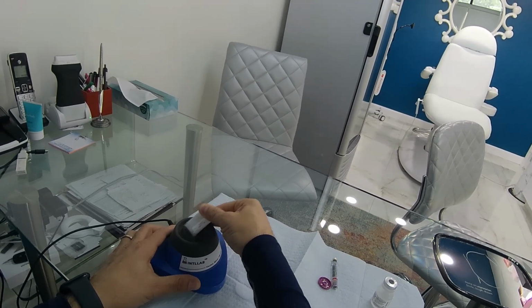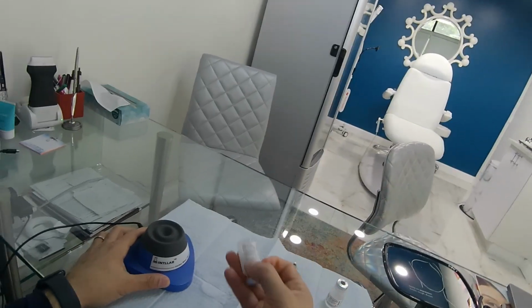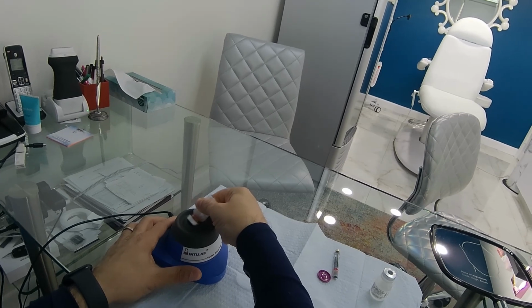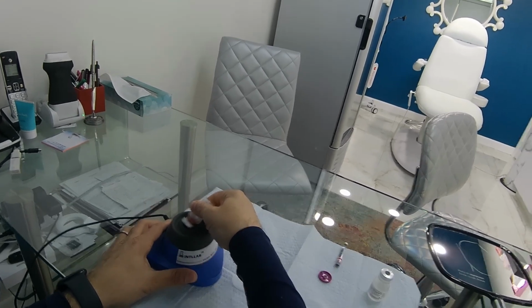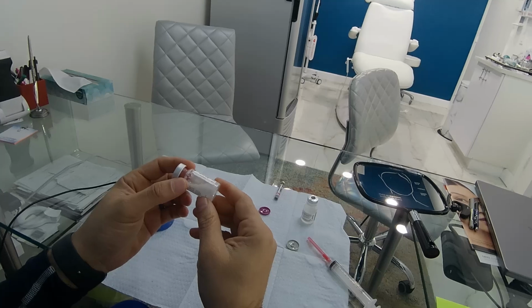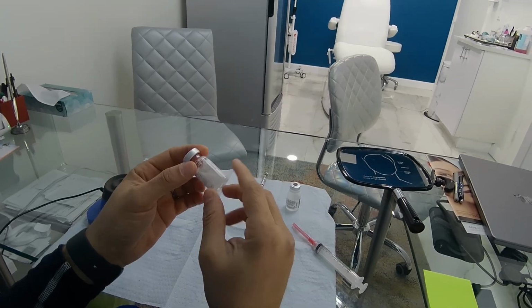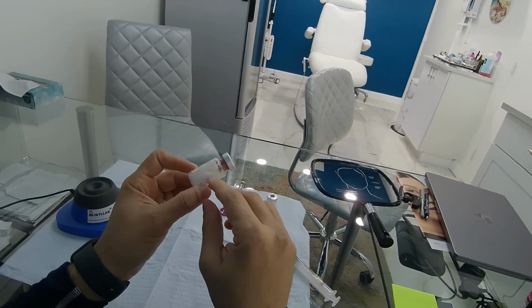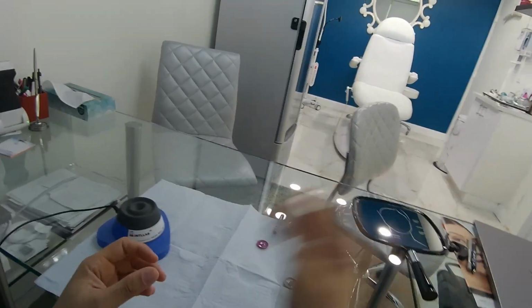Then you wait, and you just have to really keep mixing, and sometimes you can shake it, and you can do it upside down, whatever you need to do, and from time to time you just keep looking. And you see that there's a clump here. I'm not sure if you can see it with the lighting, but I know there's a clump, I can see it, so I just have to keep mixing.